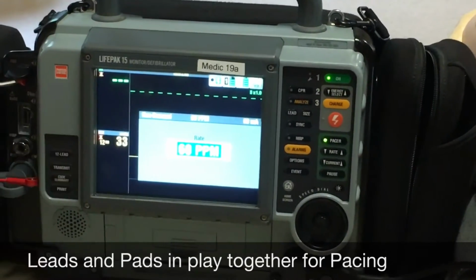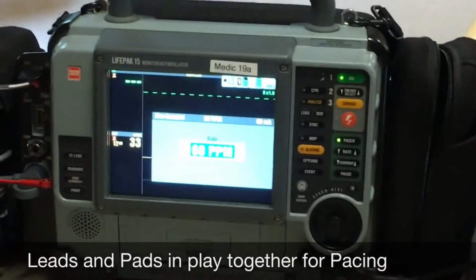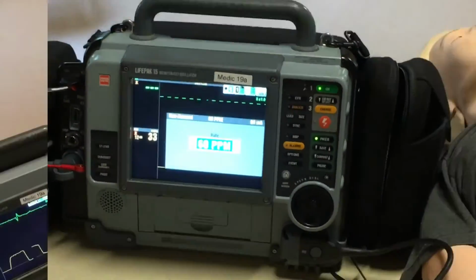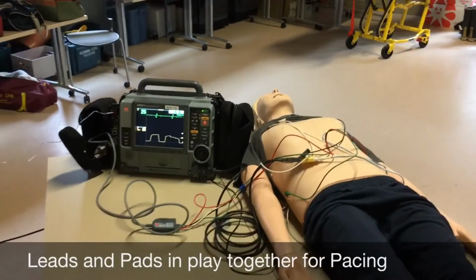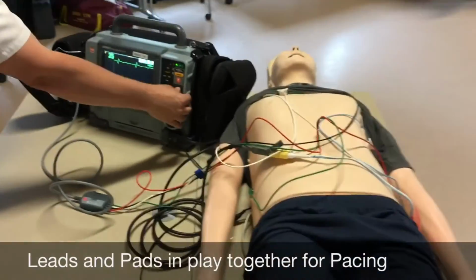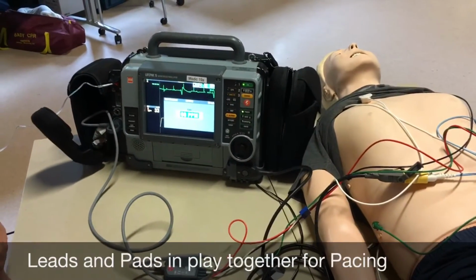So it's really important to remember that if you ever think that you're going to need to pace, or you want to plan ahead just in case you need to pace, you want to have both the leads and the pads on. Once the leads and the pads are on, then we can turn on the pacer. And we notice it automatically moves into lead 2, and we get pacer spikes along with our intrinsic rhythm.